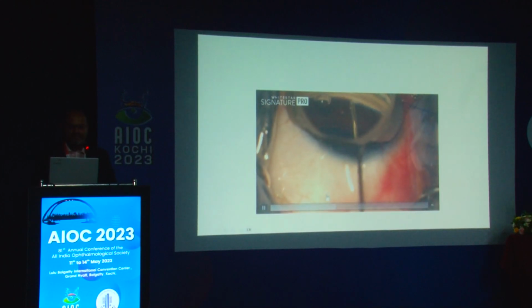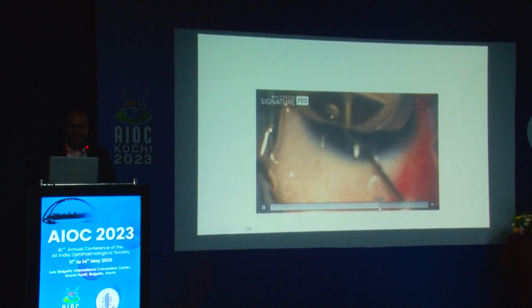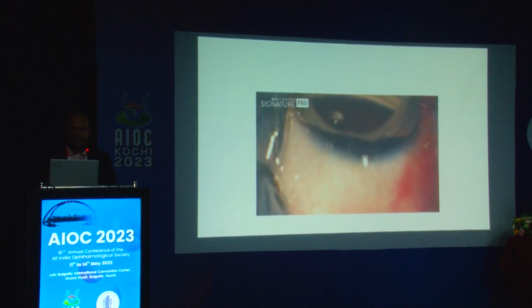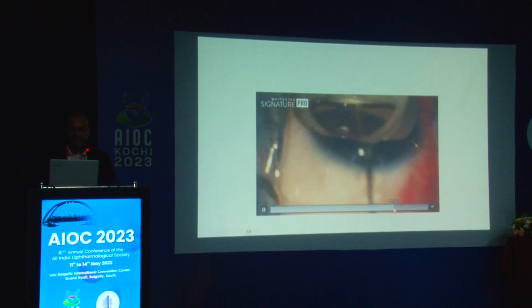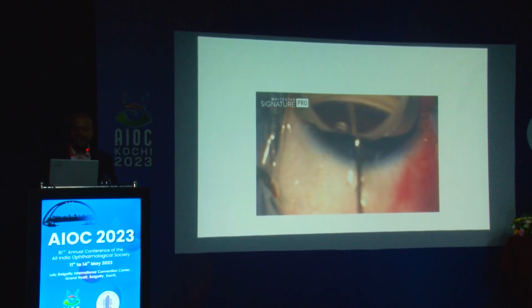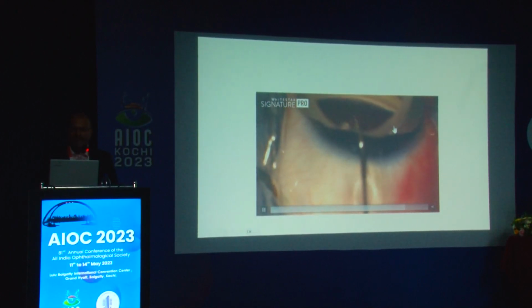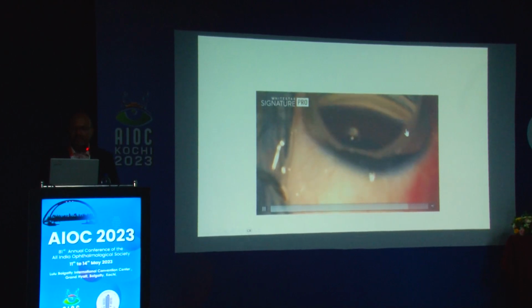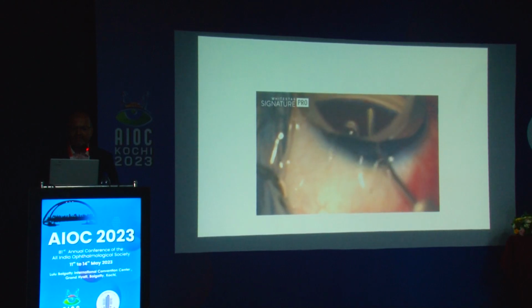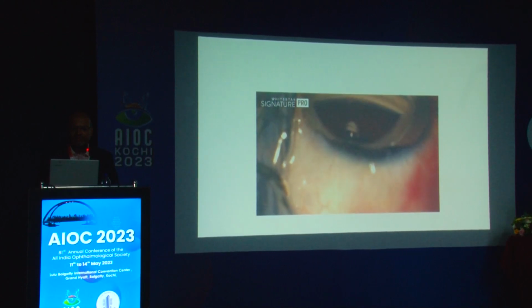And once you have introduced the suture, you should have some resistance to movement. If you don't have the resistance to movement, so I'm introducing it, it's going, and I've introduced a significant proportion of it. But as I'm introducing, the suture has actually cut the trabecular meshwork, and on the right side, on the corner, if you see, the suture will be visible in the gonio lens. So it has actually cut and come inside. So these are the early learning problems which you will have.